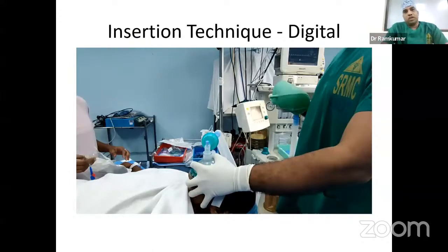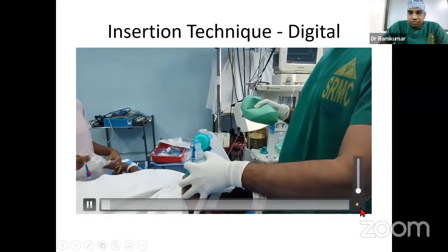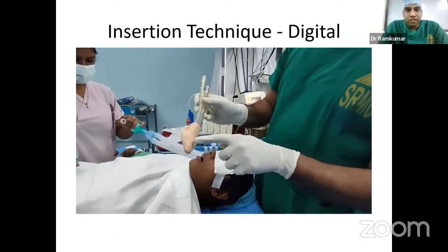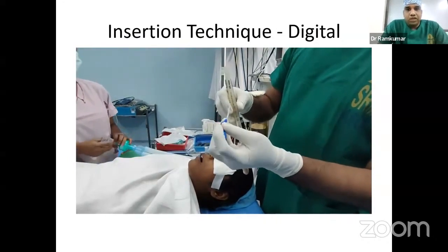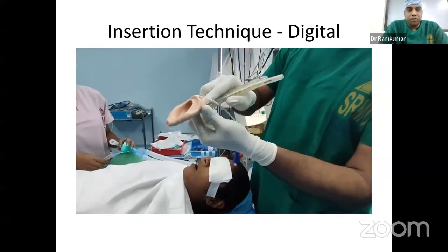Next, we'll move on to insertion techniques. The standard insertion technique for a device, as prescribed by Archie Brain, is the digital insertion technique. This I would like to demonstrate with the ProSeal. It should be in a sniffing position. Patient preparation should be at an adequate plane. You should have adequate mouth opening, at least 2 centimeters, to pass the device. And a pre-use check of the device should be done.